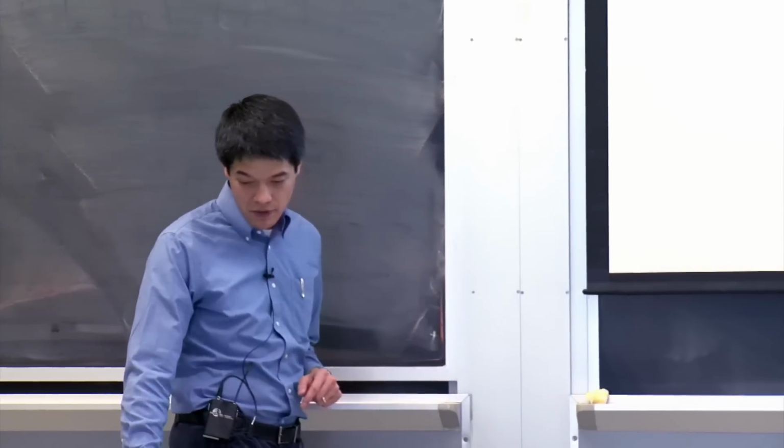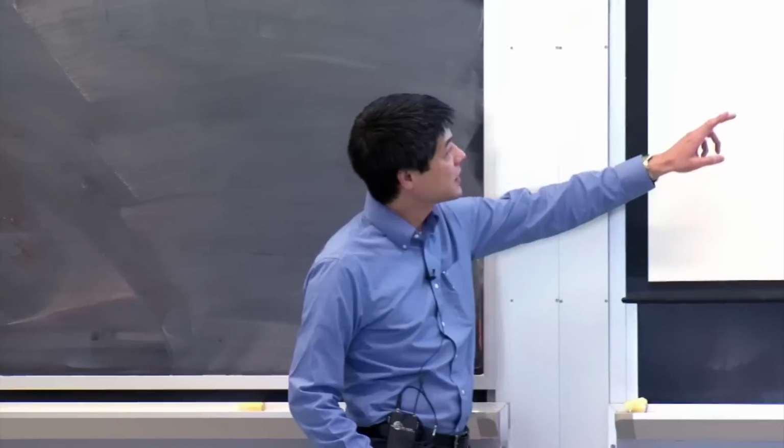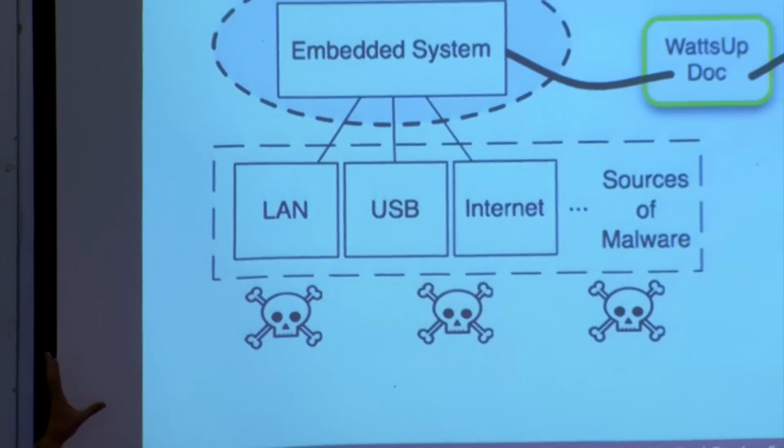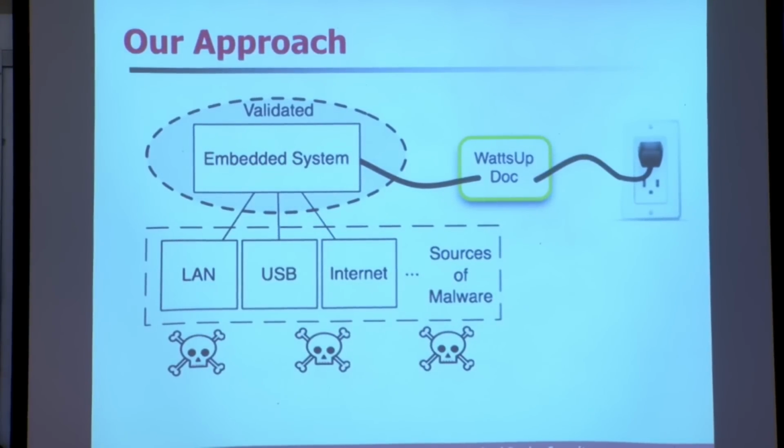And so what he discovered was that if you have an embedded system that's very difficult to change and you want to retrofit security onto it, what you can do is put in an intelligent power strip, and it uses machine learning classification of the frequency domain, actually looking at the frequency components of your power consumption. It's not looking at how much power you consume. Instead, it's looking at how often you consume it. So let me give you some intuition here.